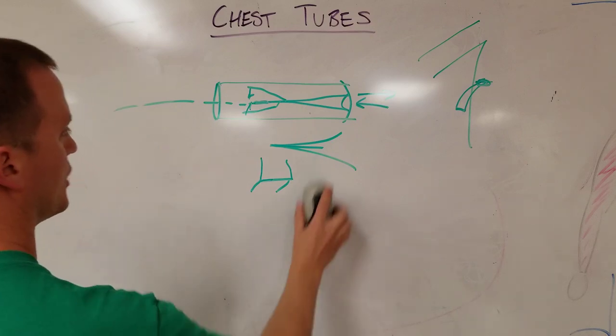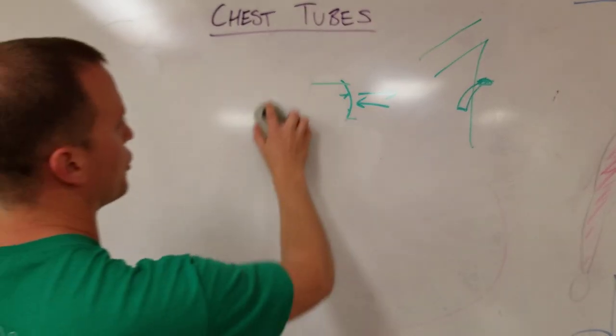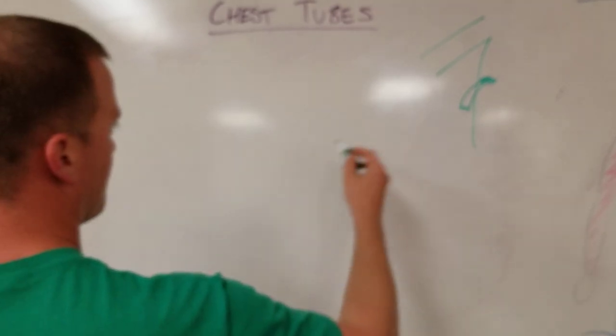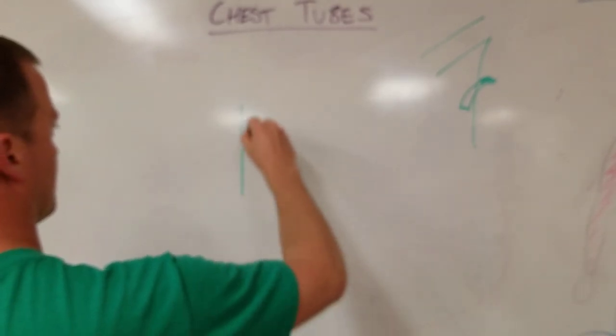That is one option if you're trying to transfer this patient, you don't have a pleurovac, or you don't have some sort of fancy device to hook it up to. But that's kind of an aside. And really what I wanna talk about is your three container system that most pleurovacs and Oasis vacs and things are set up on, whether they're wet vacs or dry vacs, which is a topic for another day. But in any case, you have this thing. The first thing you wanna set it up to is your collection chamber.